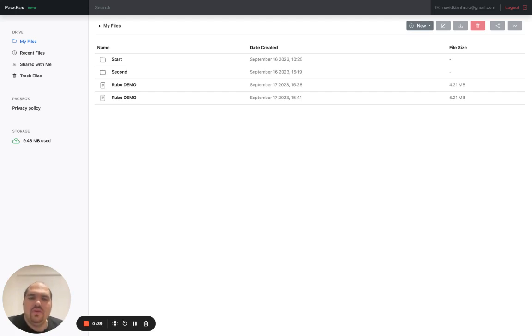Commonly, what we do within the hospital environment is we use IEP to send images between different hospitals. It works really well, but it, first of all, is very slow, and secondly, it doesn't really work when you're outside your hospital PACS system, what you're used to.